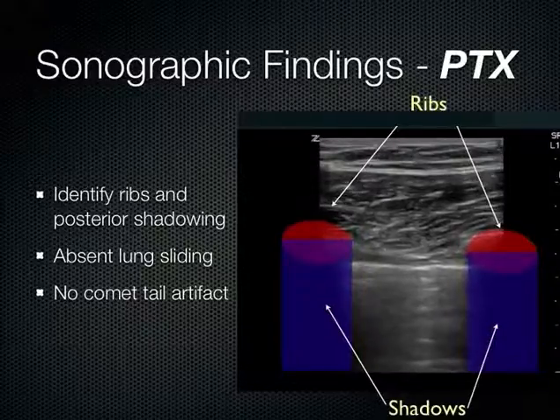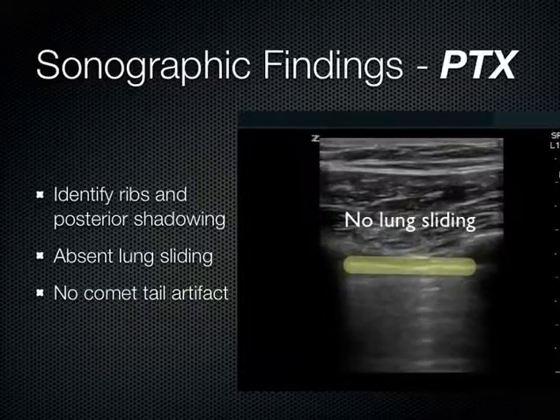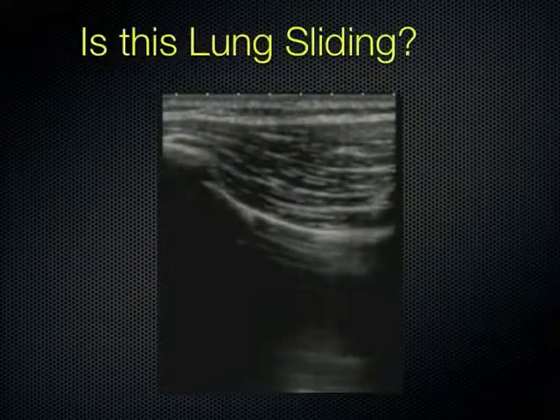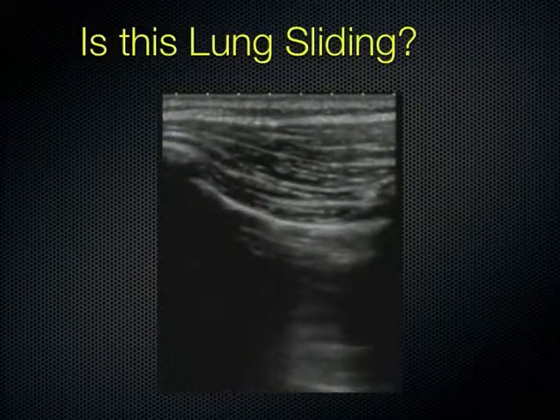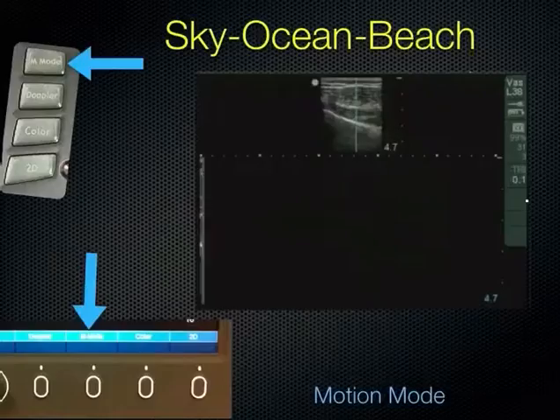Moving on. Just a couple examples. Is this lung sliding? So, pneumothorax or not? No. Good. You're experts now. That's really all you need to know. How difficult is it to get that image? Very easy. You will all be flying through this and then looking at kidneys and hearts later today because it's very easy to get the image. Okay, so we're moving on to M mode.